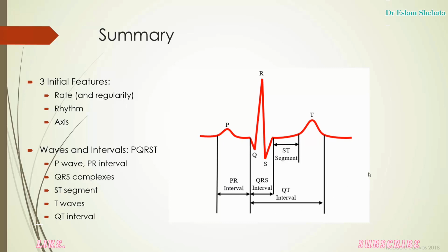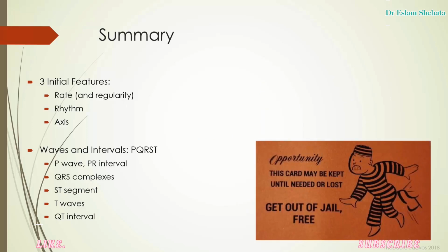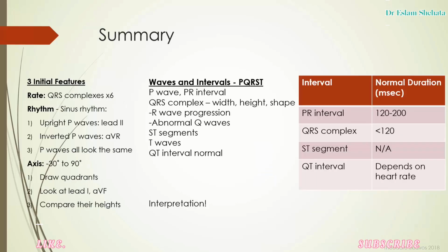It doesn't matter whether you use that system or some other system that you prefer, as long as you have a system and you use it when you interpret the ECG, it really is a get out of jail free card. Even if you have no idea what's going on, if you can describe everything on the ECG to your consultant, then they can help you out. Now, this slide's really just for your reference. I've tried to cram everything I've discussed onto one slide, more for revision purposes than anything else. Alright, I hope it helps.